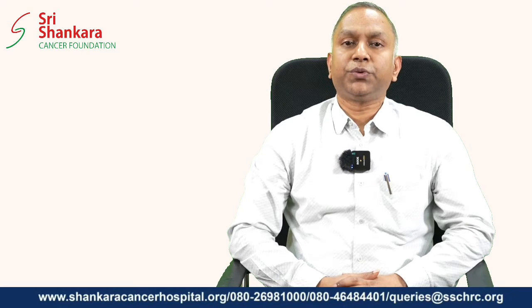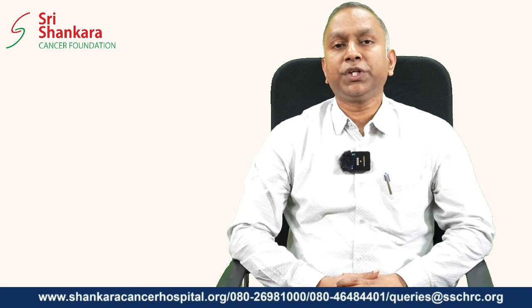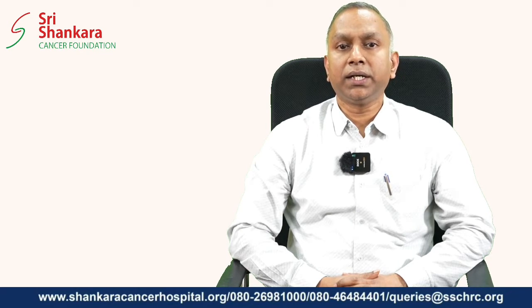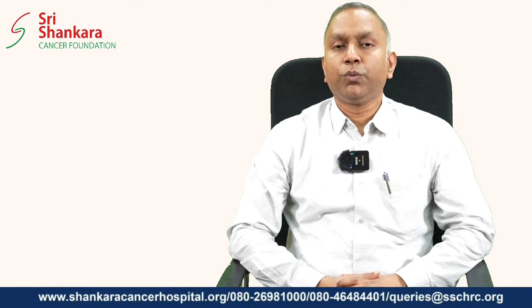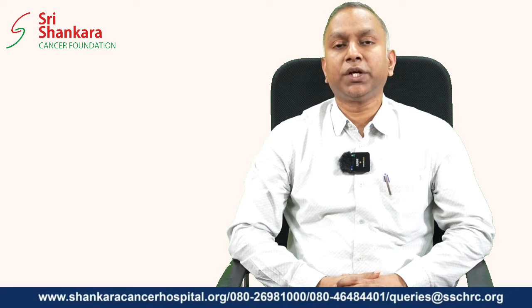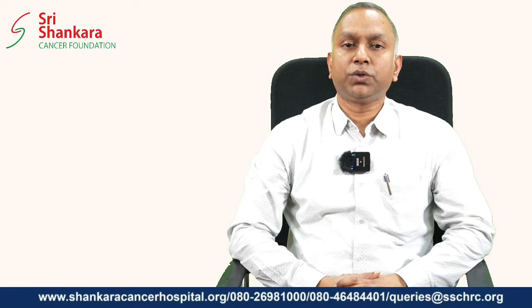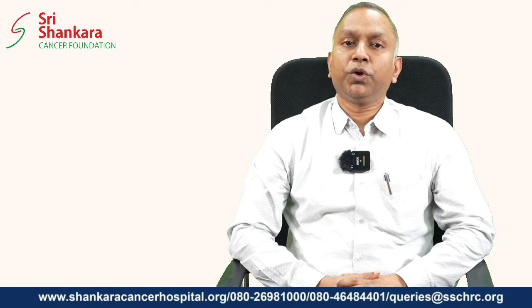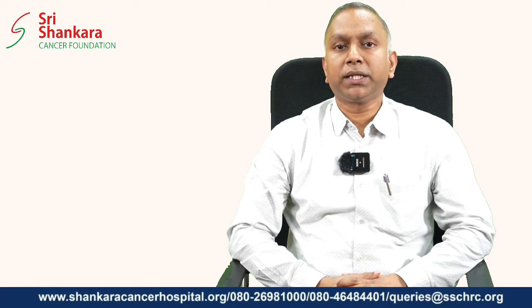There are some situations where brachytherapy can be done alone, but most of the time there will be a combination of external radiotherapy and brachytherapy. The most common area where brachytherapy is done is gynecological malignancies. In carcinoma cervix there is always a combination of external radiotherapy and internal radiotherapy. Once cervical cancer patients have been decided to be treated with radiotherapy, there will be an initial 5 to 6 weeks of external radiation, following which there will be a gap of 2 weeks and the patient will then be taken up for the brachytherapy procedure.